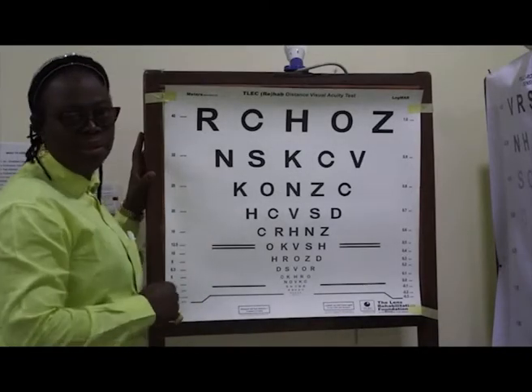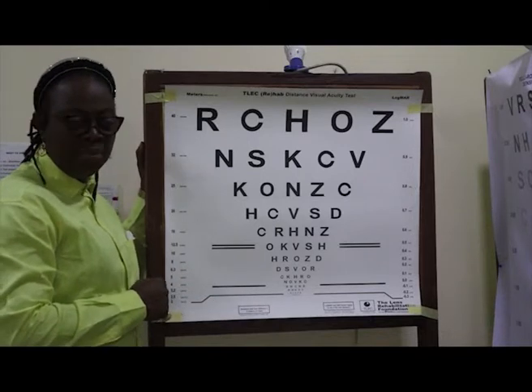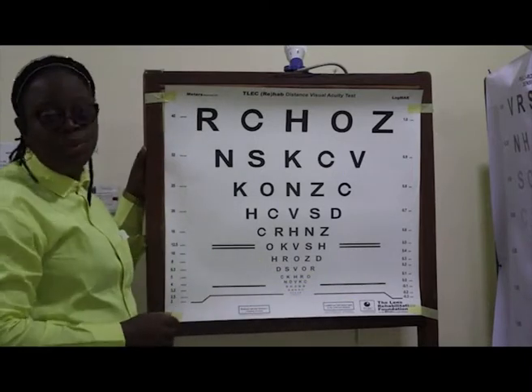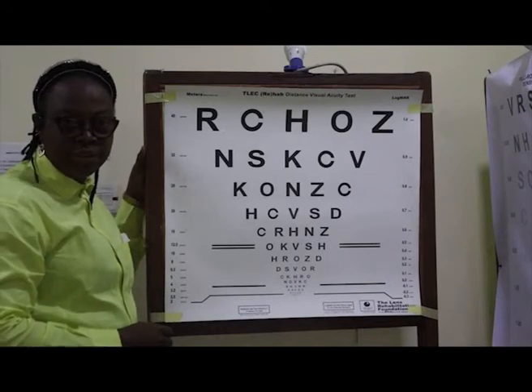Before now, eye care workers have been using the Snellen visual acuity even to evaluate low vision patients. But it is advocated that the LOGMAR visual acuity chart is what should be used for that purpose. So it's important for us to know how to record the visual acuity.